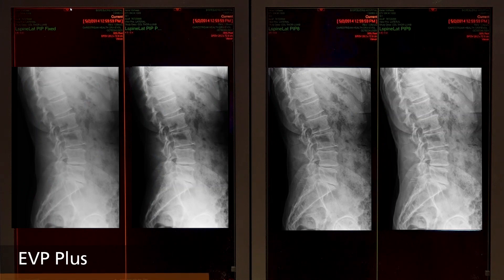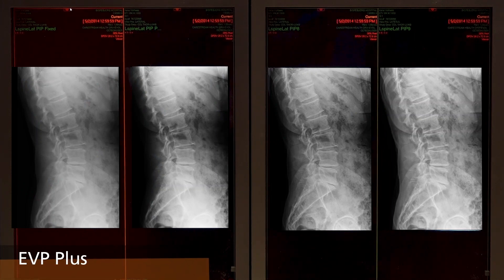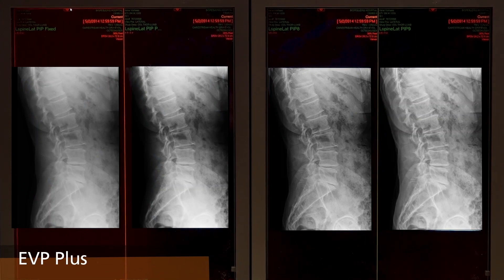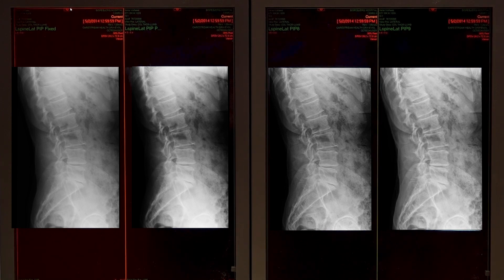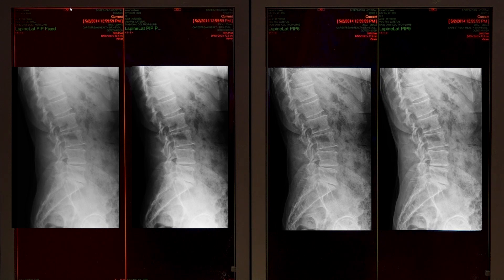EVP Plus provides a number of default looks, as shown using multi-frequency processing, with the ability to perform further customization to a site's preferences for automated and consistent presentation.